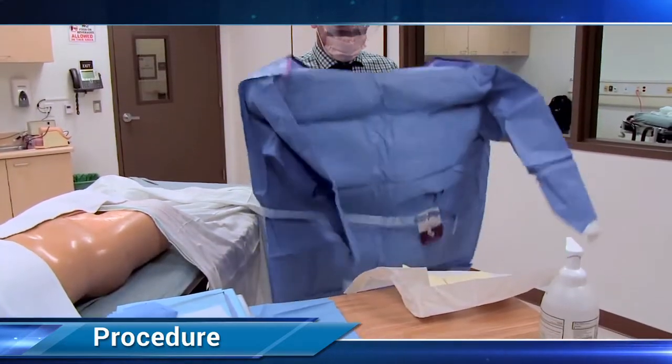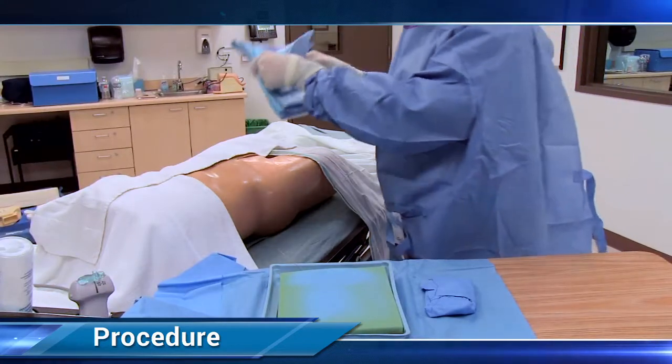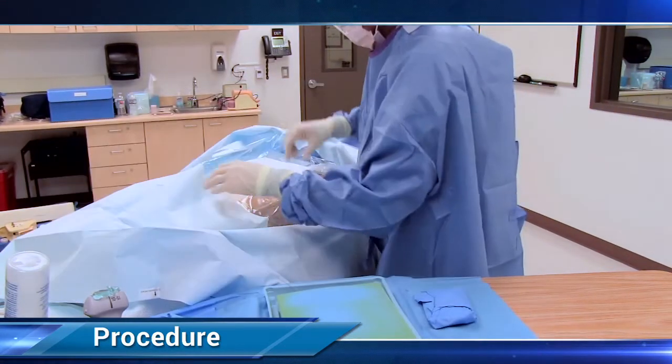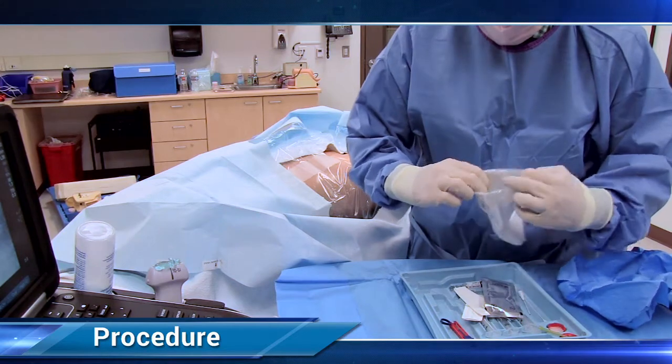Then put on your sterile gown and sterile gloves, and fully drape the patient. And place the ultrasound probe sterilely into the probe cover.